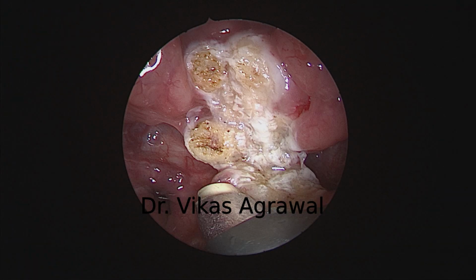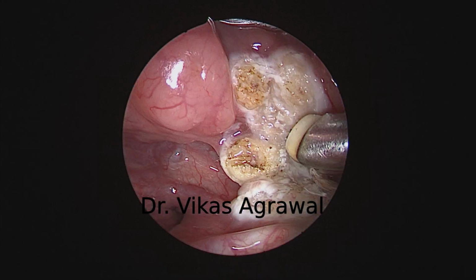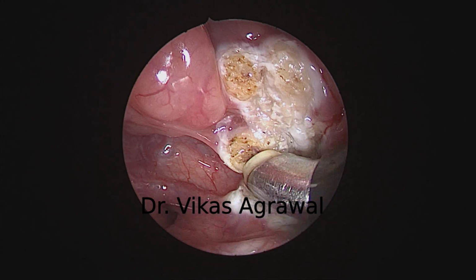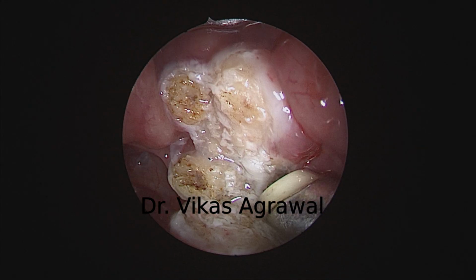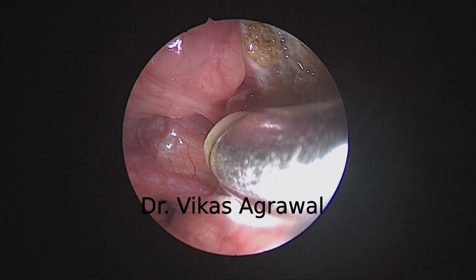and I'm only coagulating the median area. Now see, the lateral glossoepiglottic ligament is here. This extra is nothing here. This is not obstructing. This is the only thing which is obstructing.